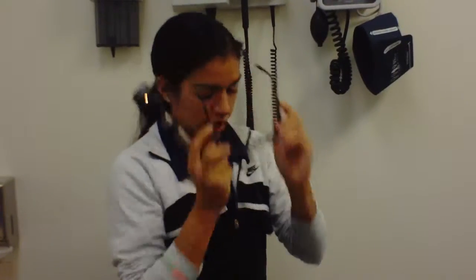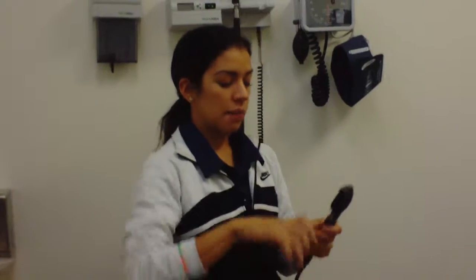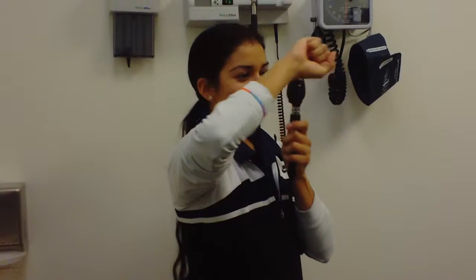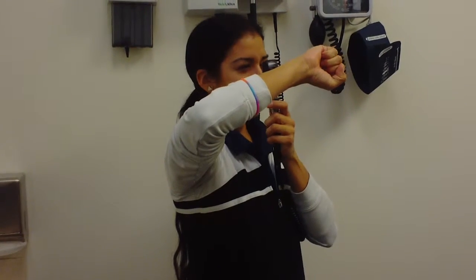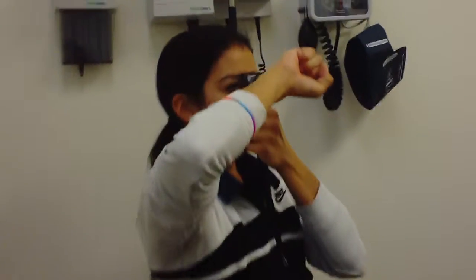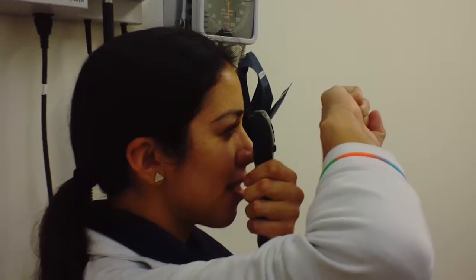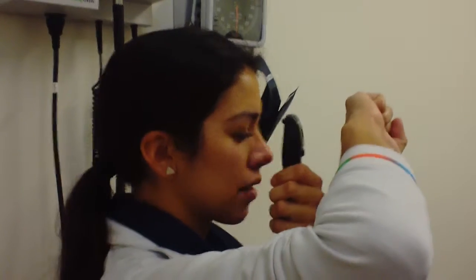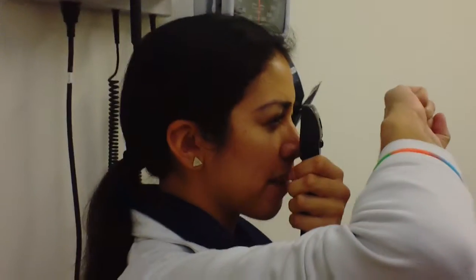So I'm going to go ahead and test without using my glasses, making sure that the light intensity is on high. And I'm going to raise up the back of my hand, to about this height, here would be about 3 inches away from my face so that I can see the line appropriately in the back of my hand. Okay, so I found that my number is a 3 for my short focal length.